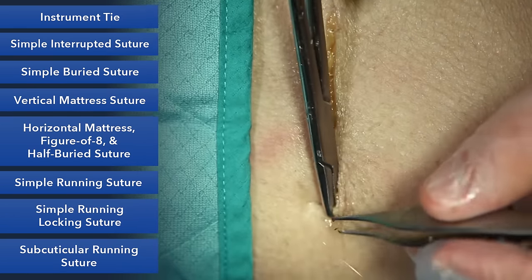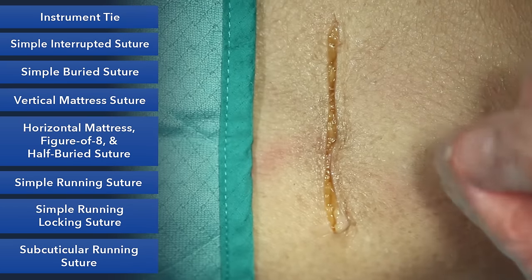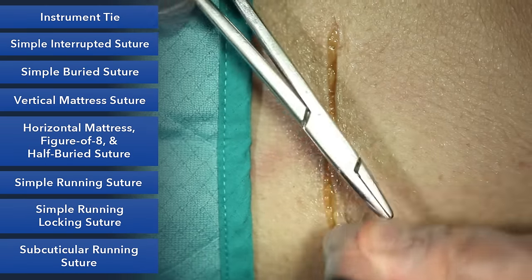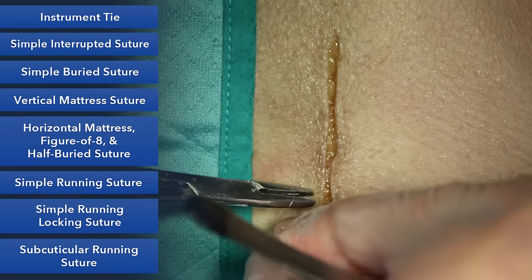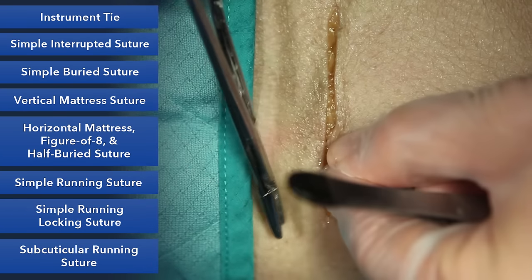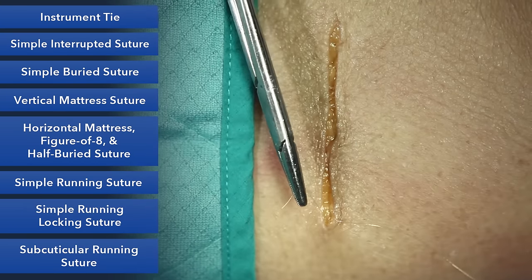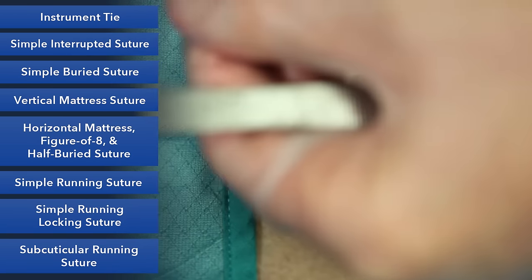So I'll go deep in the corner, away from the skin, maybe just the very deepest part of the dermis. And we'll do our instrument tie, and this allows the knot to be buried so we can suture over it. This is important because we don't want knots coming up to the skin. They can stick out. It's called spitting. And patients do not like it when the knots spit.